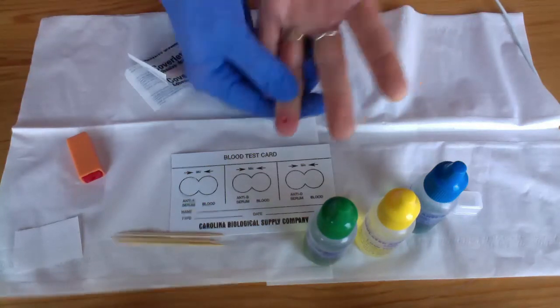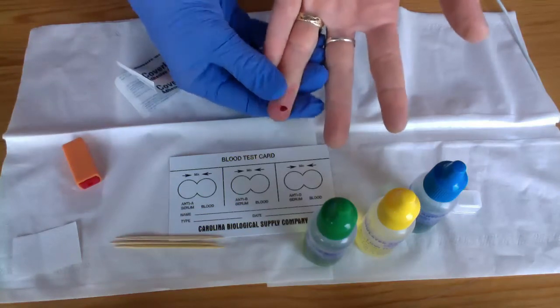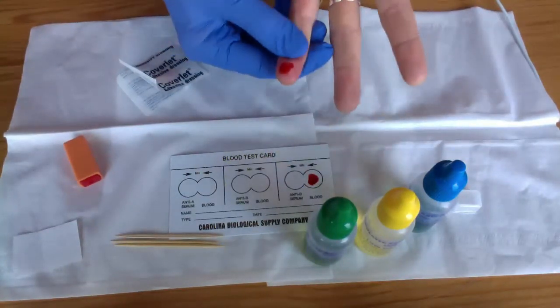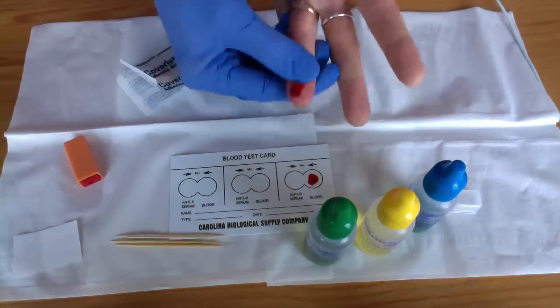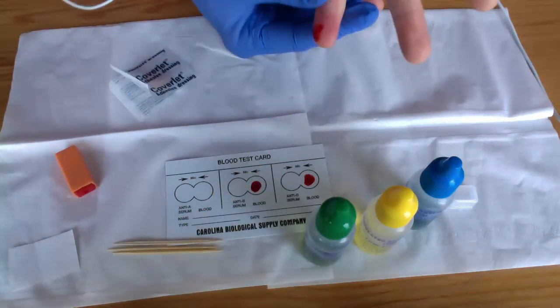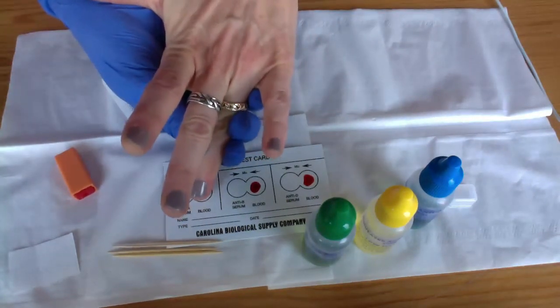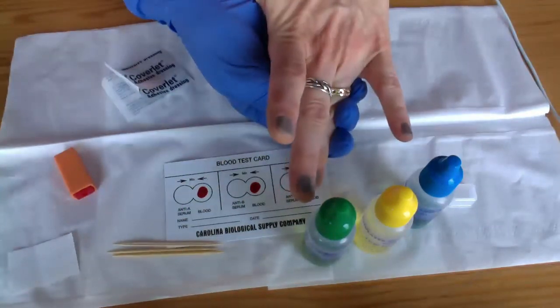I'm a clotter, so you can see here I'm going to really get a nice drop of blood, and then you're just going to stick that drop of blood on each section of the blood test card. And hopefully you can see this. I'm not able to see this as it's videoing because I have this on my computer. So you're going to stick that down there. So I have a nice sample of blood here on each one.